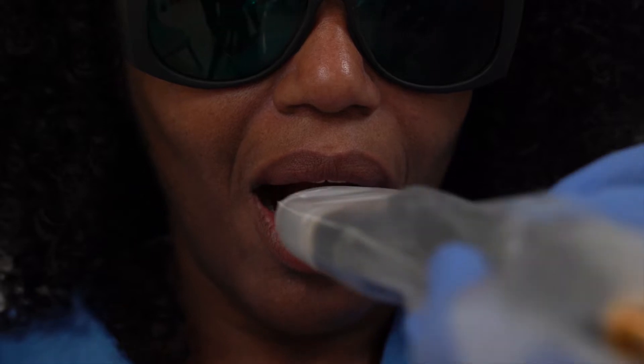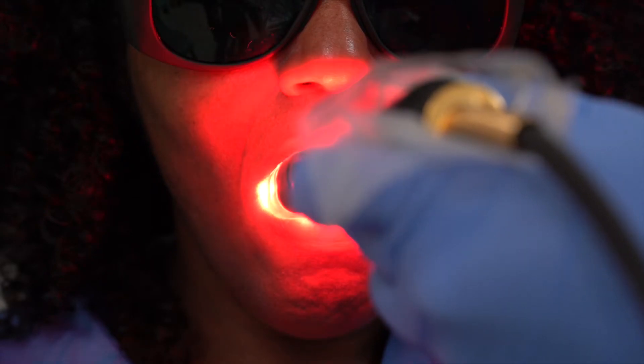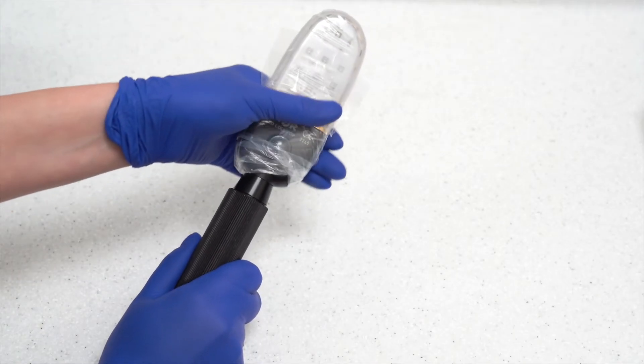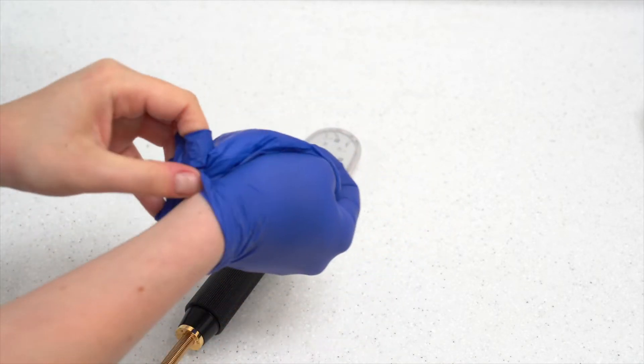For the second position, the patient should raise their tongue to the roof of their mouth and the probe should be guided underneath the tongue. Once in position, the patient can then relax their tongue over the probe for the exposure.